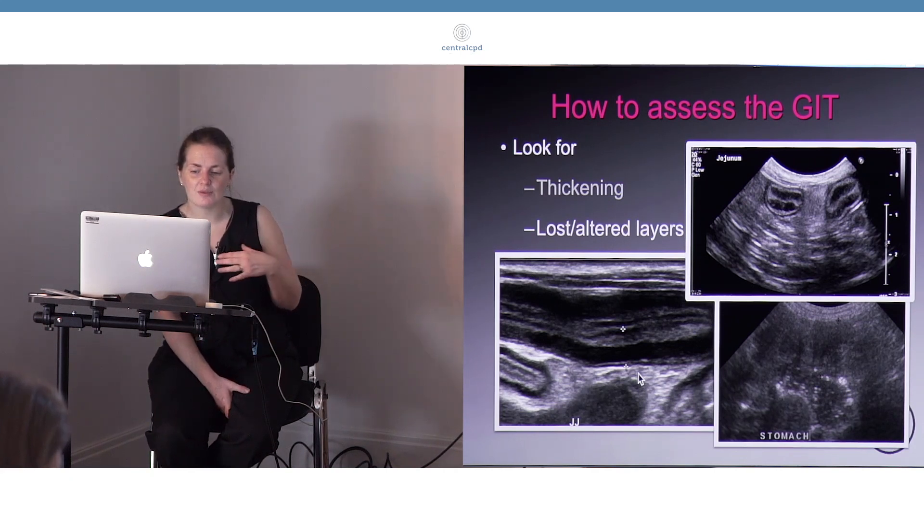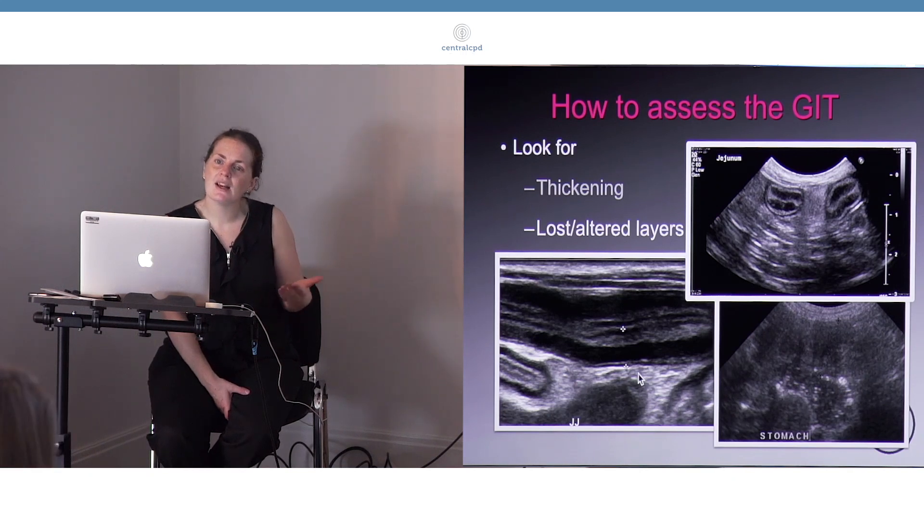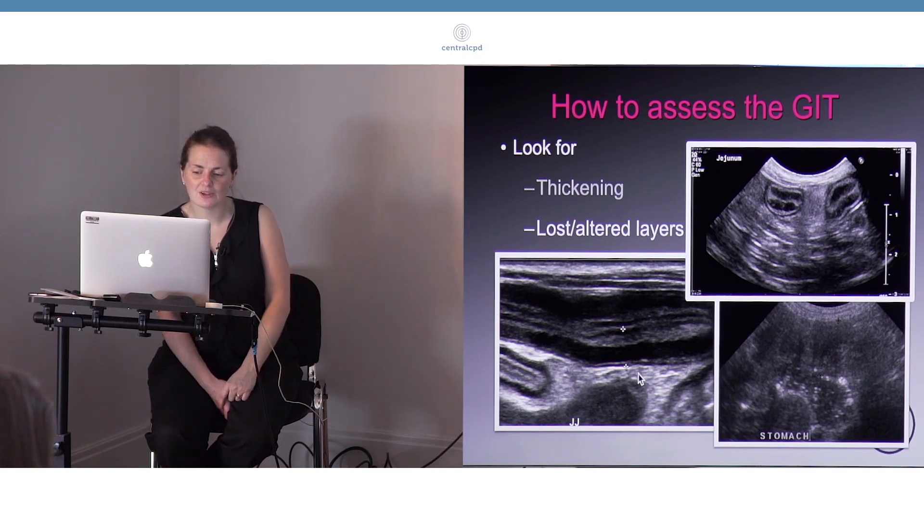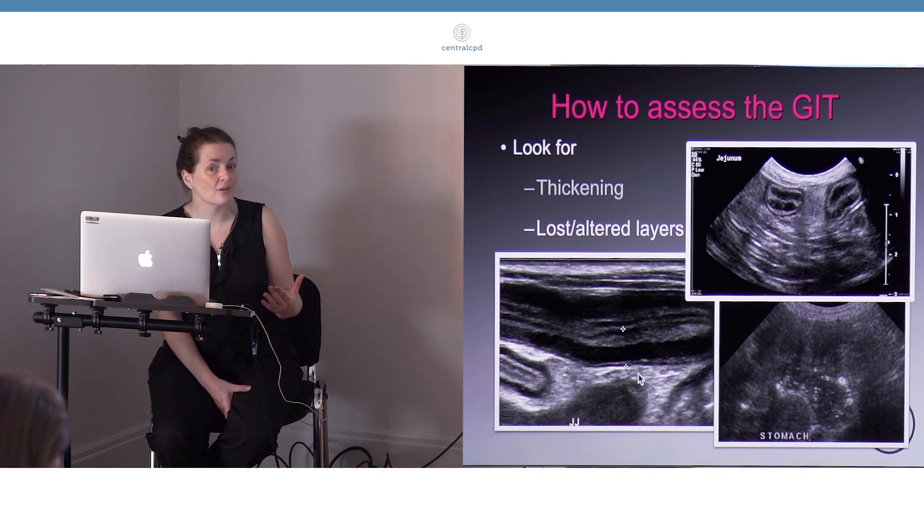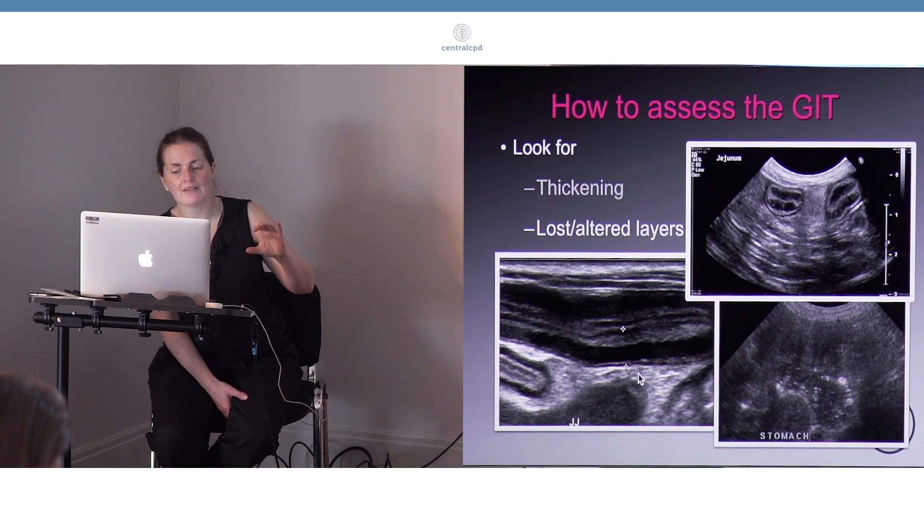Some of them have been associated just with chronicity, maybe some fibrosis being deposited. In cats that's been shown—some of these cats have chronic IBD, have had extra layers. In some cases, it's been shown as having no clinical significance whatsoever.